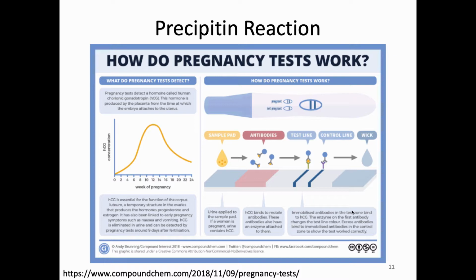And you'll be able to detect that the antibody that you picked up here was actually bound at this location because this antibody is able to bind this antigen and has a color marker on it. You also have another control line where this antibody just binds to this colored antibody that you have that makes a second line.